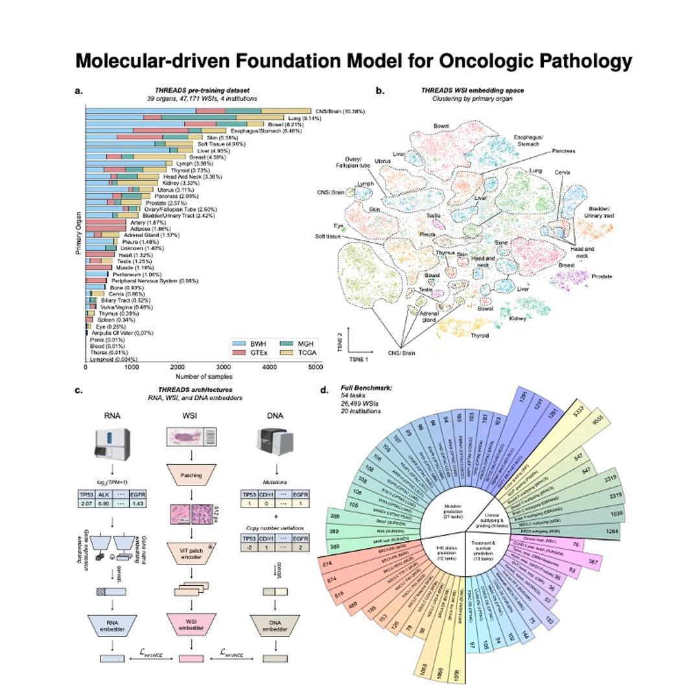Think of it as asking, how close in this learned feature space is the visual appearance of this new sample to the established molecular fingerprint of, say, IDH mutation? That's incredible. You're basically using stored molecular knowledge to guide the visual classification for a task the visual model wasn't explicitly trained on. Did it work?